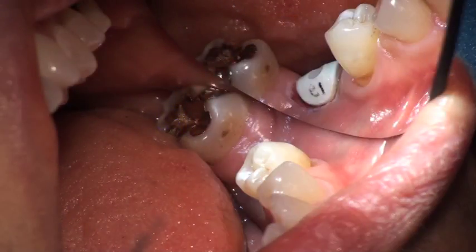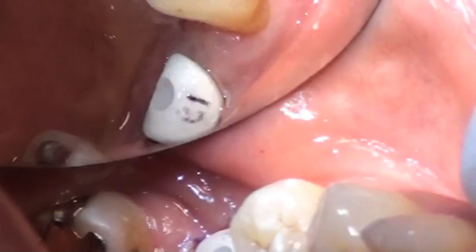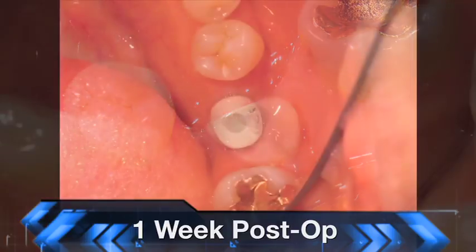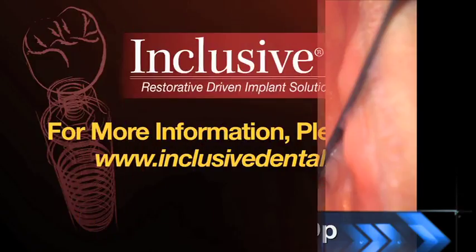Once things have set, you can go back and polish and remove any excess. This is what the patient leaves with that day — the implant placed, the healing abutment in position, and everything ready for nice healing. The final shot is one week post-op, and you can see the soft tissue has healed nicely and things are progressing very well, setting things up nicely for prosthetics down the road.